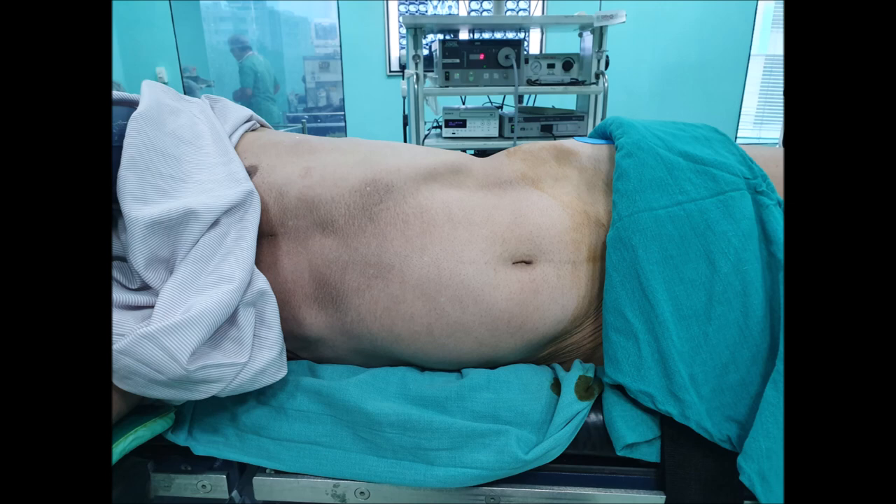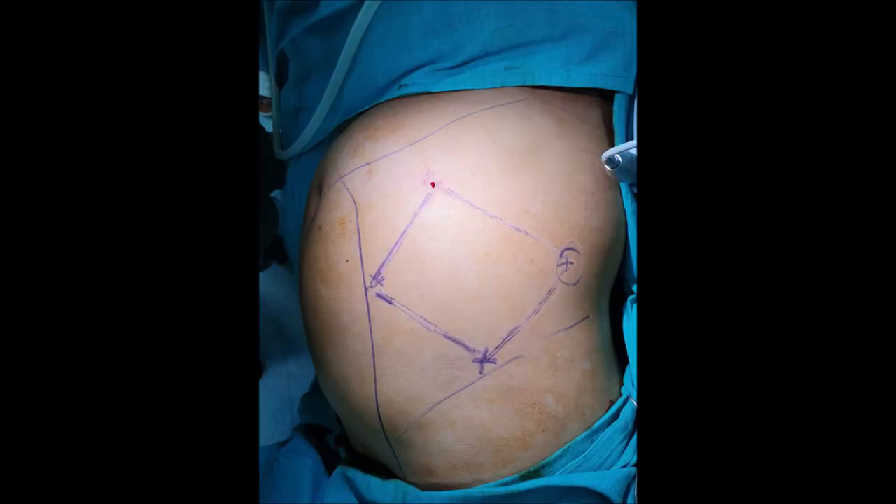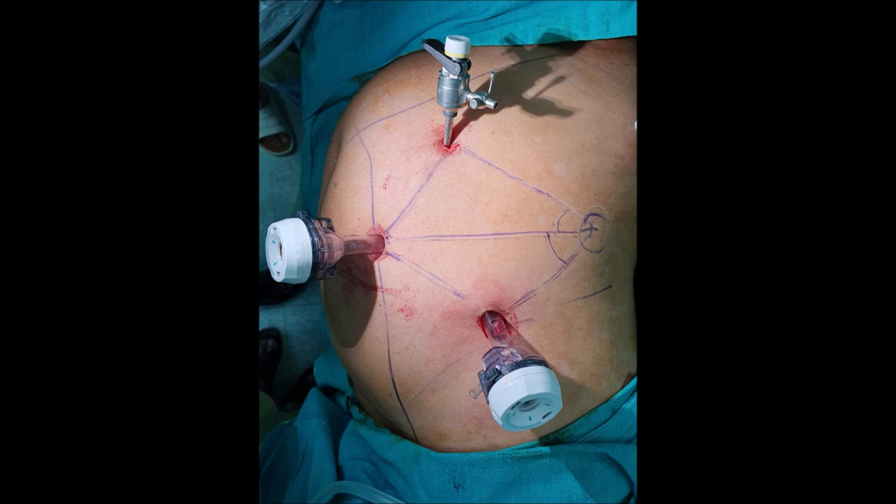To mark the respective ports on the abdomen, let's take the example of planning a left nephrectomy. After creating the pneumoperitoneum, the site of the left adrenal is marked on the abdominal wall and the hand is placed such that both index fingers are on the target site. The meeting point of the thumbs becomes the camera port and both anatomical snuff boxes become the secondary ports. If unsure about the target dissection point, we can introduce the camera port, touch the target with the telescope, move upward until we see the light on the anterior abdominal wall, mark that point, and then place the hand in the diamond concept accordingly.